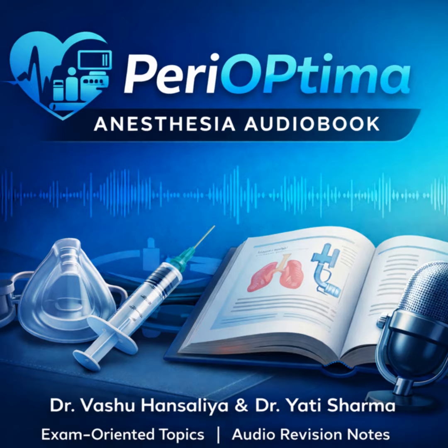Okay, they're consented. What about monitoring and positioning? Standard ASA monitoring is non-negotiable. Pulse oximetry, NIBP, ECG. And here's a critical exam detail. Continuous ETCO2 monitoring is often unreliable during AFOI. Why is that? Because the scope creates a significant air leak, especially in the nose. So expired gases escape around the scope instead of going through the sampling line.